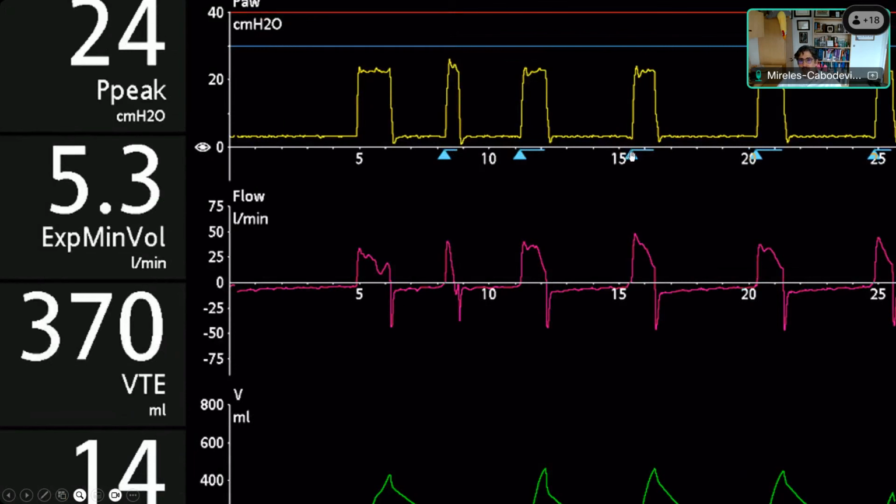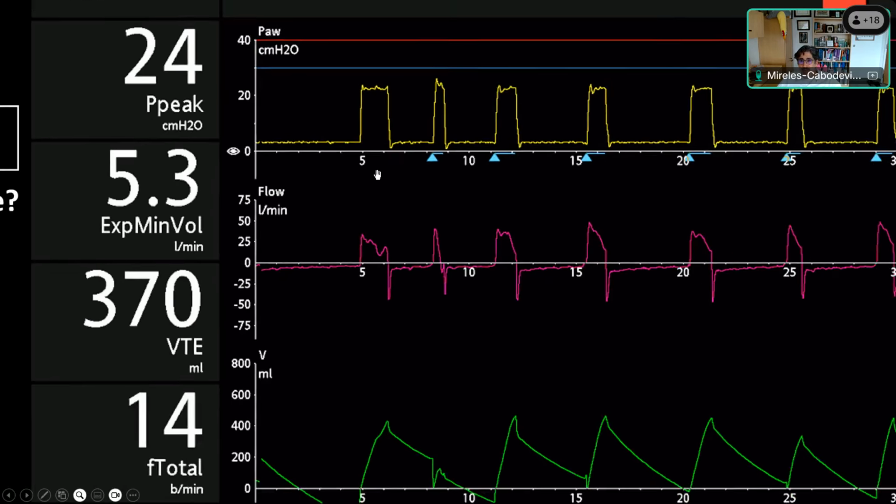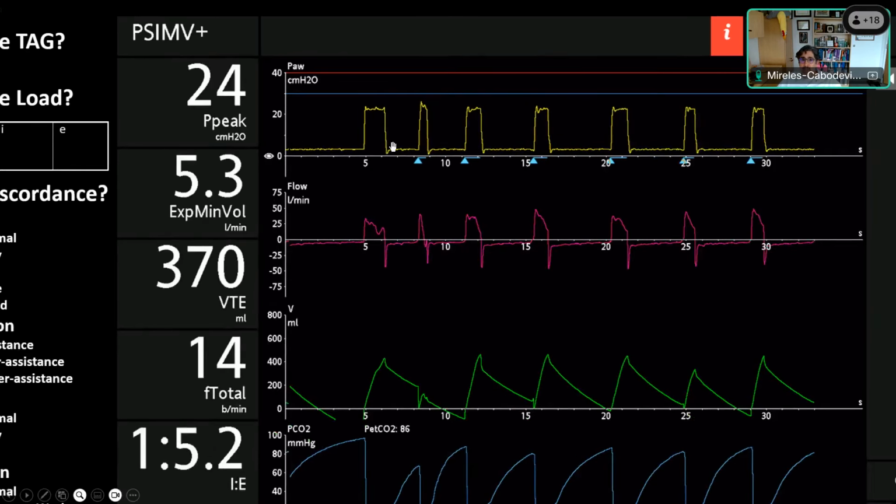So now, instead of using the percent flow and the liters per minute that I had set before, it's using the automatic detection threshold system that they call IntelliSync. And again, we're on the same mode. And actually, this shows it a little bit better than the other one. You remember that I told you that it was IMV type 2.